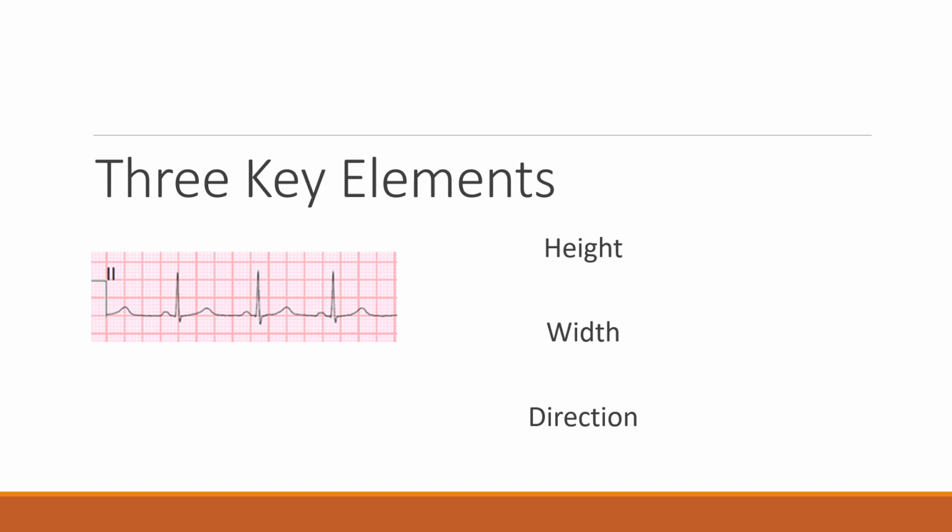They give a lot of information, and I think a lot of people skip over or gloss over these things, and a lot of the really complex ECG interpretation that we do really just boils down to taking those little bits of data and then applying it to that ECG map, so knowing where these leads look, and then painting a picture about what's going on in the heart.